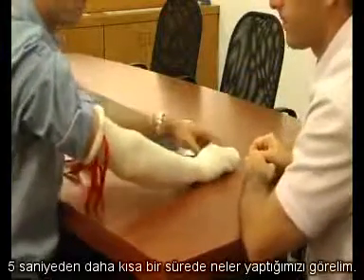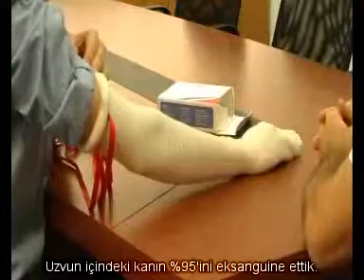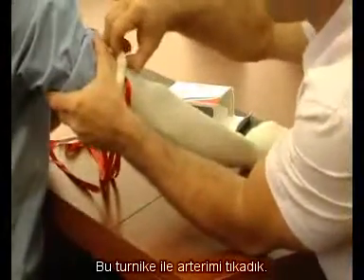Let me take the straps. Let's see what you've done in less than 5 seconds. You have exsanguinated 95% of the blood from the limb. You have occluded my arterial flow. You can feel this is the tourniquet. Wow.